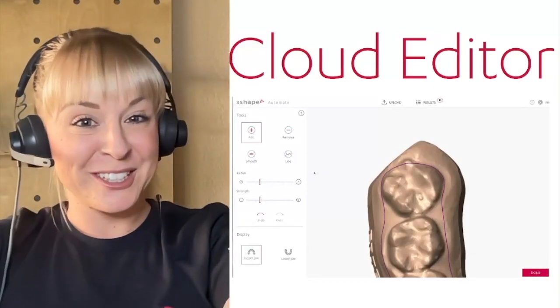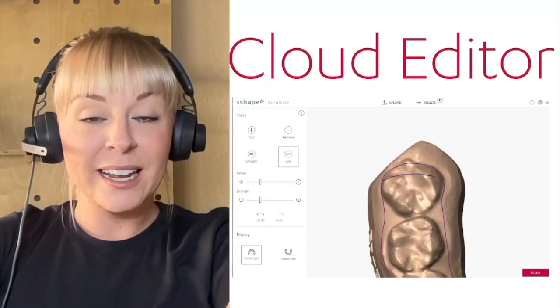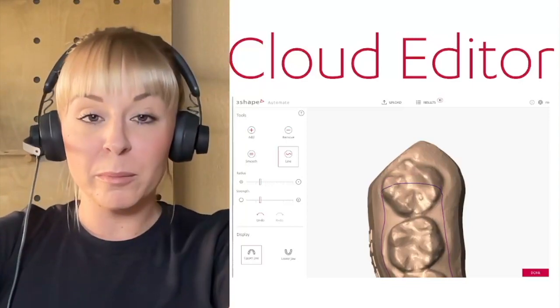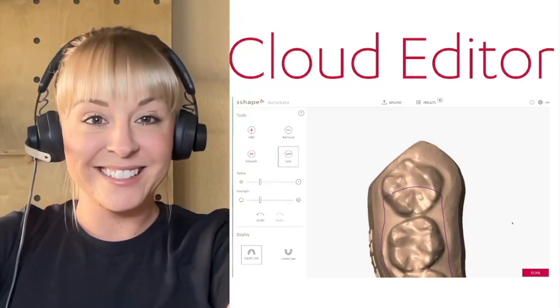That's not all — there is also the Cloud Editor, which allows you to edit the trim line in your browser. If there's something you don't like about the trim line, or you simply want to move it, all you do is hit the Line button, redraw the line, and hit Done. Easy as that.